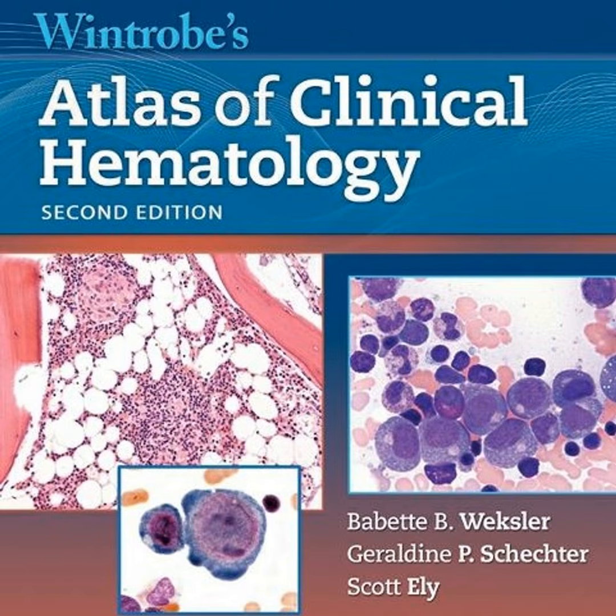And the prep itself is highly standardized. Yeah. We're talking Romanowsky-based staining methods, usually Wright or Giemsa stain. And the chemistry here is just fundamental to everything we see. You've got two dye components. First is eosin. That's the acidic dye, right? It is. And it binds to alkaline structures. Think hemoglobin or the granules inside eosinophils. It gives them that characteristic red or orange color.